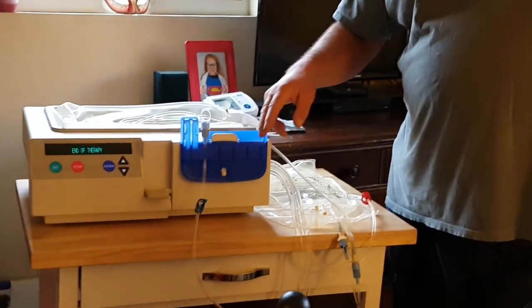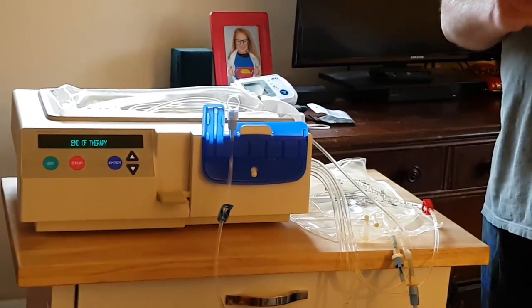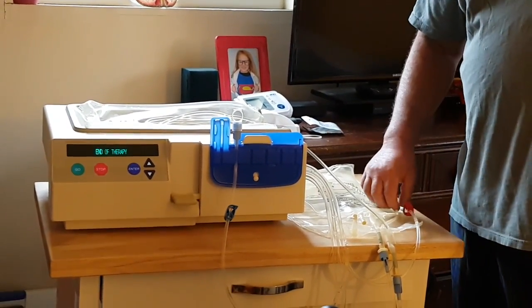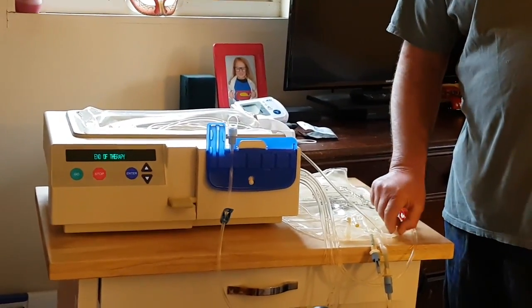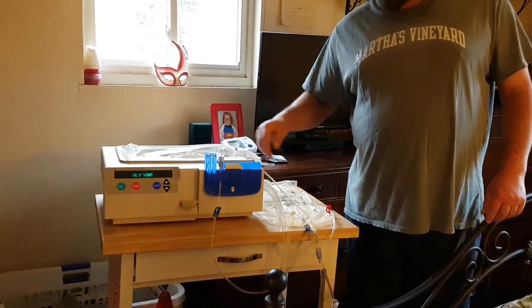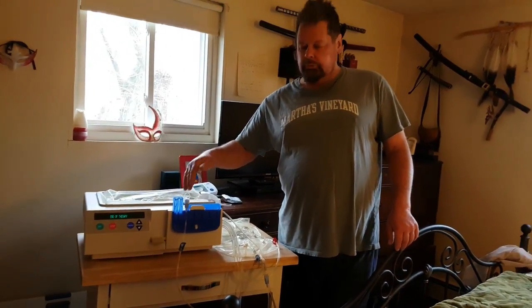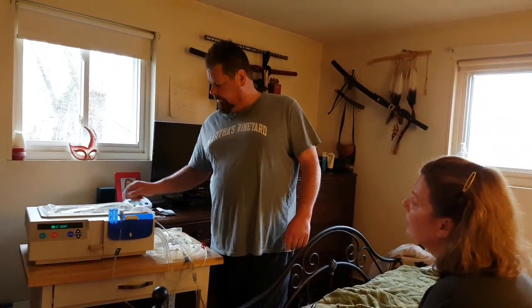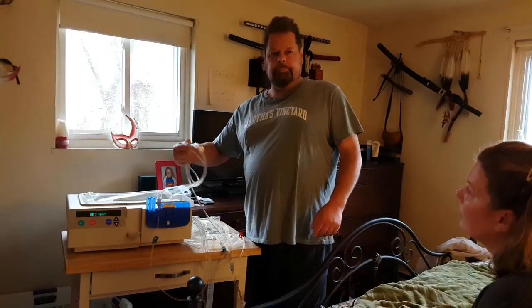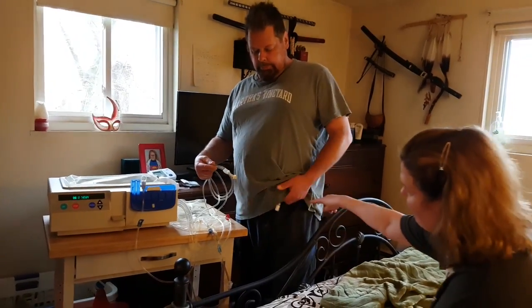And when you attach them, you have to wear a mask and you have to be sanitized. And you attach the red one first to the main bag, and then the next bag, and the next bag, and so on. This one I don't use. This one's for medication in case you need to. And then the last tube goes to me. And that's this tube. Mm-hmm. And that's the tube that goes in your stomach. Yeah.